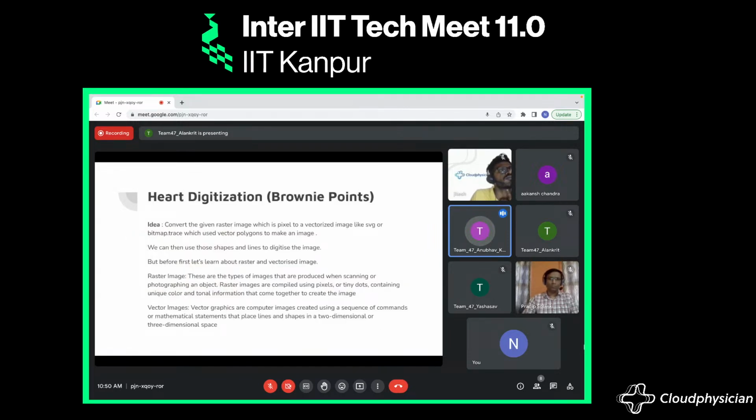So now let's go to the brownie points part, heart rate digitization. In the cropping section, we have cropped the monitor into different parts, and from here we are getting only the graph image of the heart rate monitor. What we have thought of doing is converting the raster image, which is pixelated, into a vectorized image.